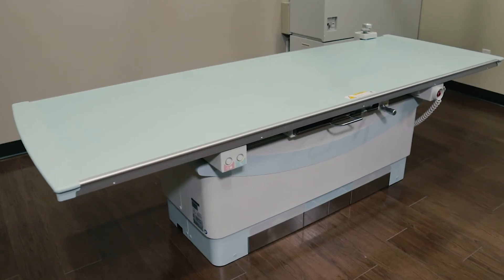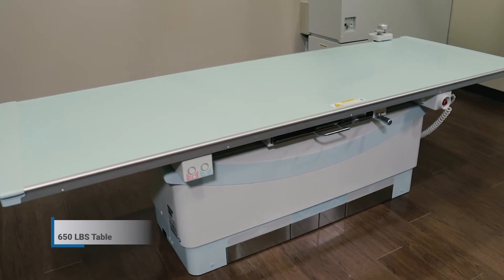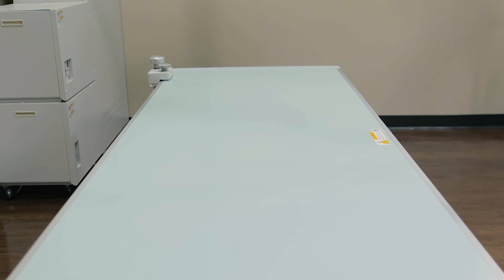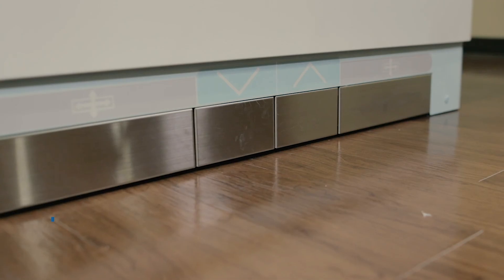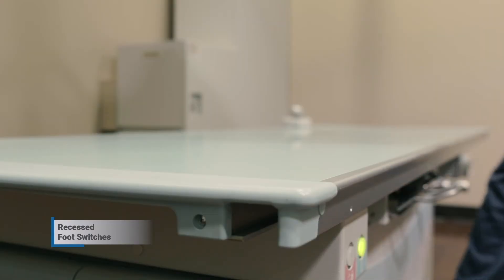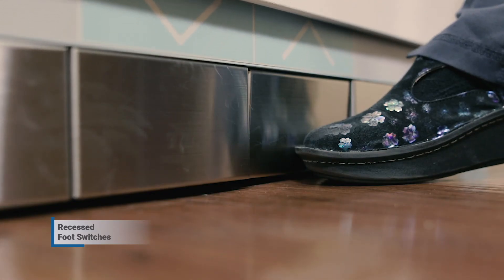The RadSpeed Pro comes complete with a durable 650-pound weight limit table. Shimadzu's smooth tabletop design allows for easily transferring patients from any cart or gurney. The recessed foot switches located at the base of the table ensure complete patient safety, as they prevent unintentional table movement while exiting the table.